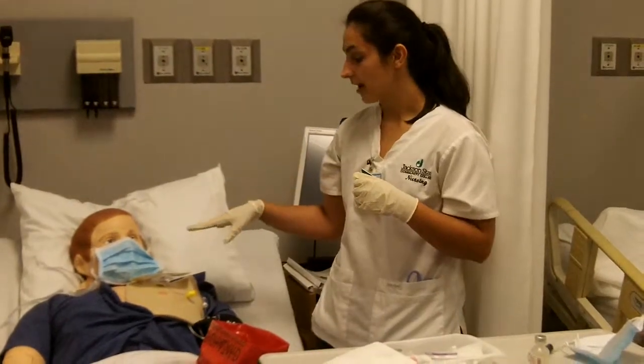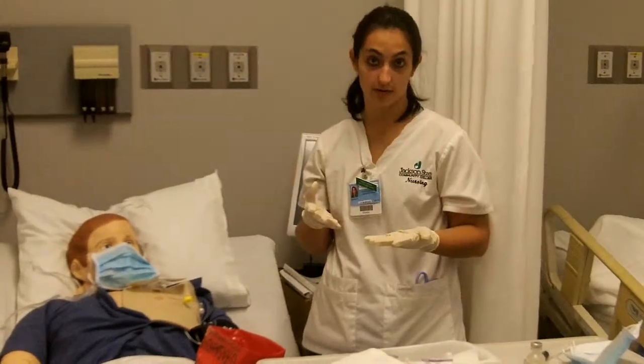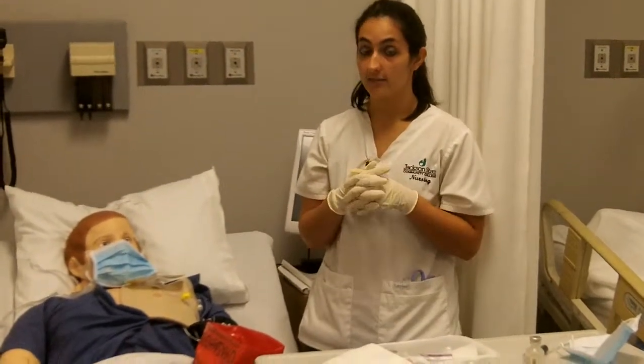And that's another thing. I would assess the drainage, the patch that I did take off, I would assess that for drainage, and I would also chart that in my notes as well.